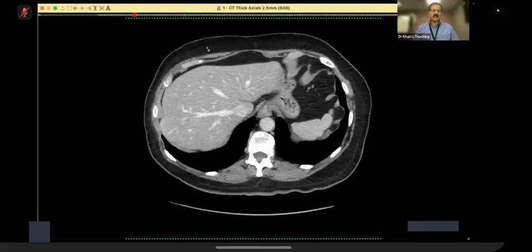In LI-RADS classification of focal lesions in cirrhosis, this is now known as an ancillary feature. So with hepatobiliary specific contrast, just remember, if there are no hepatocytes, it will be black. Black is bad. Yes, black is bad. So that is how it is.